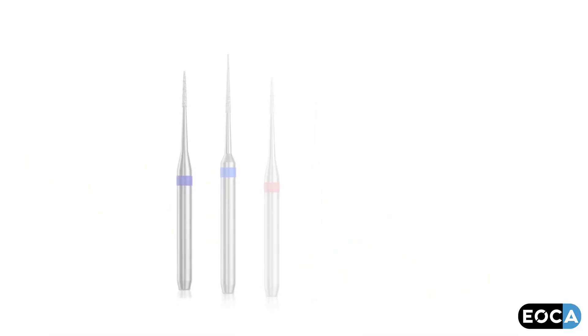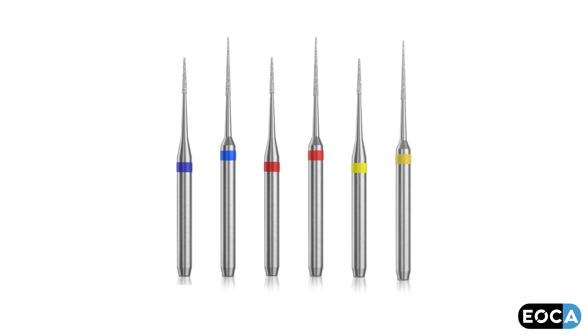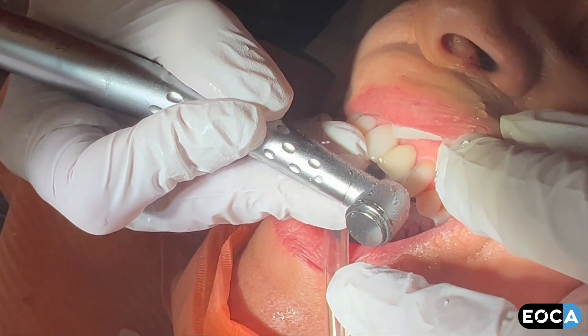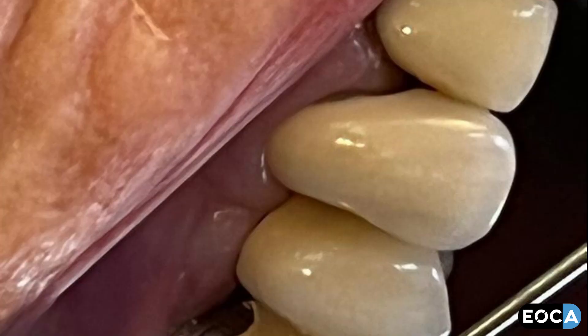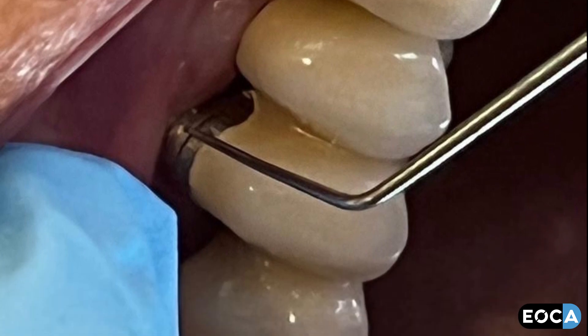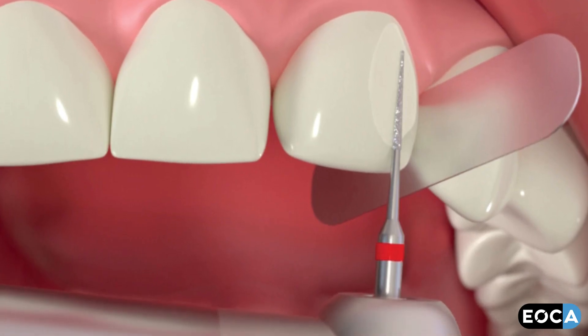The primary purpose of the exquisite margins restoration finishing burrs is to create an interface that is smooth, uniform, and easily cleaned by the patient. This will increase the longevity of the restoration, decrease the incidence of recurrent caries, and promote the health of surrounding tissues.